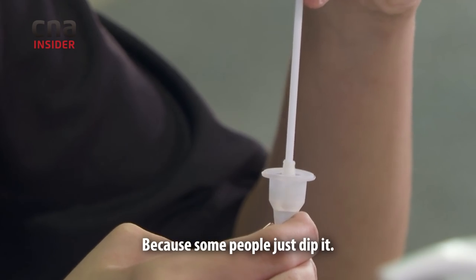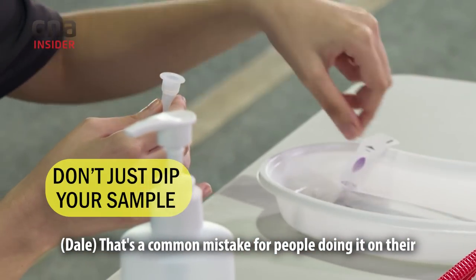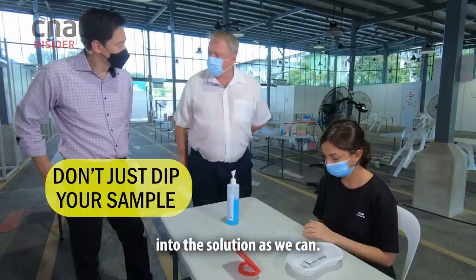Is that squeezing really important? Because do some people just dip it? That's a common mistake for people doing it on their own. If there's virus there, we want to get as much of the viral particles into the solution as we can.